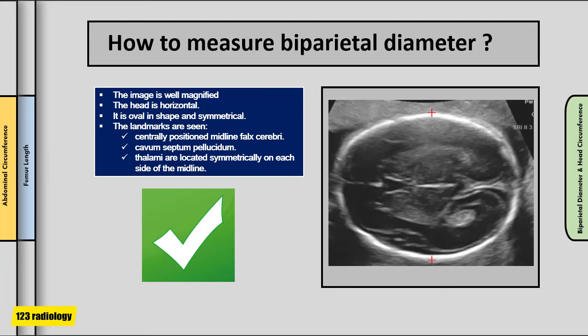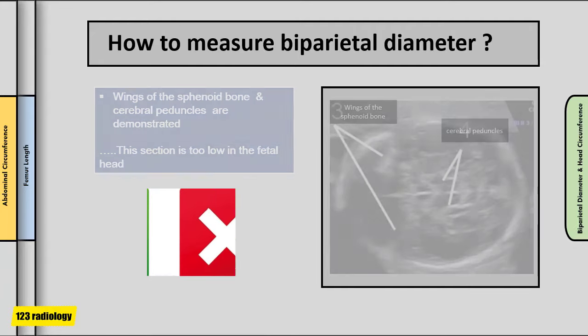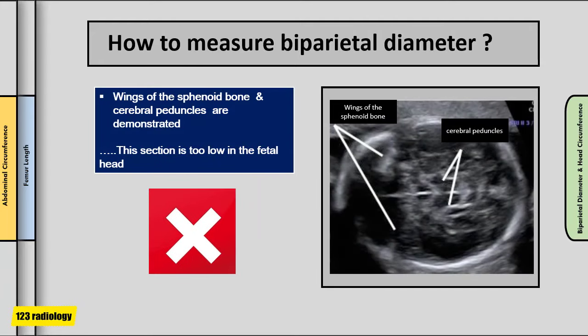This is an example of correct biparietal diameter estimation. The image is well magnified, the head is horizontal and oval in shape, symmetrical, and the landmarks are seen clearly. The falx cerebri is centrally positioned as a continuous midline echo, broken anteriorly by the cavum septum pellucidum, and the thalami are located symmetrically. Calipers are placed outer to outer. In the incorrect example, the wings of the sphenoid bone and cerebral peduncles are visible — this section is too low in the fetal head, leading to incorrect estimation.